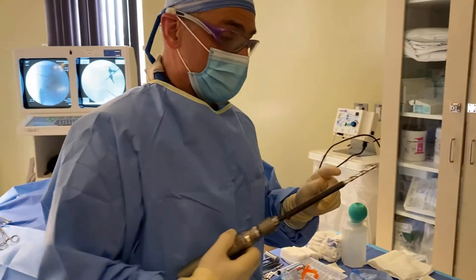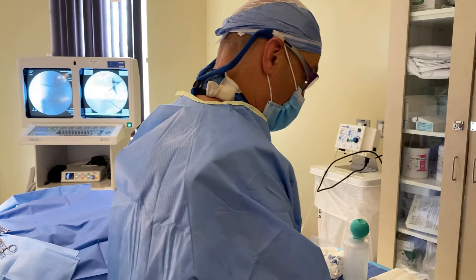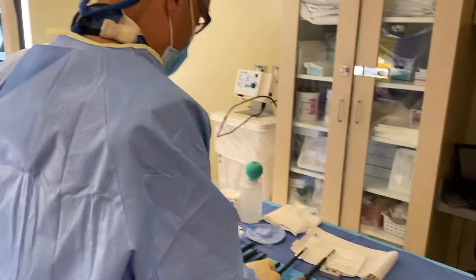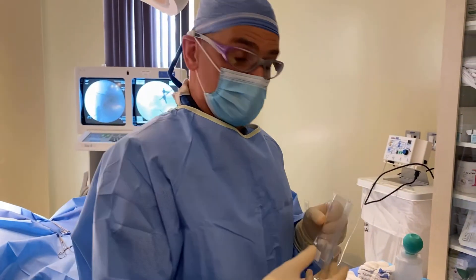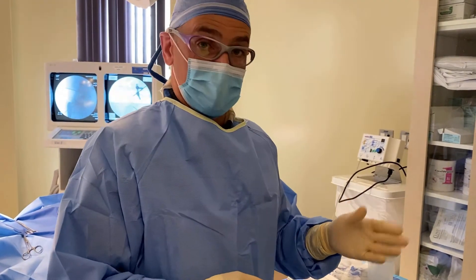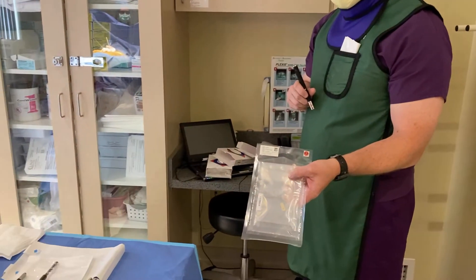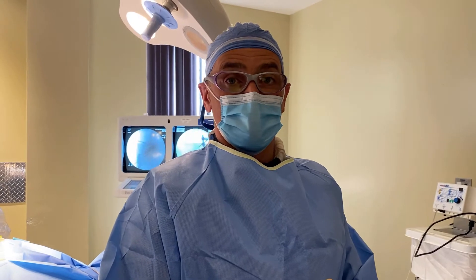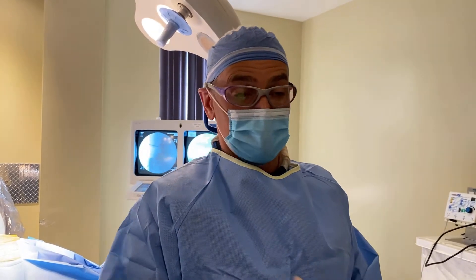We'll drill a round hole into each section of the SI joint — top and bottom, inferior and superior. Once we drill that hole, we'll make it square using this broach device. Then we'll place demineralized bone matrix spongy material into each of the openings and deploy it. We'll also insert tibial or femur allograft — bone graft from a cadaver — into those openings, which provides immediate mechanical stabilization. That's why patients can do so well immediately after treatment, without waiting 6 to 12 weeks while the demineralized bone matrix allows the body to grow and fuse the SI joint.